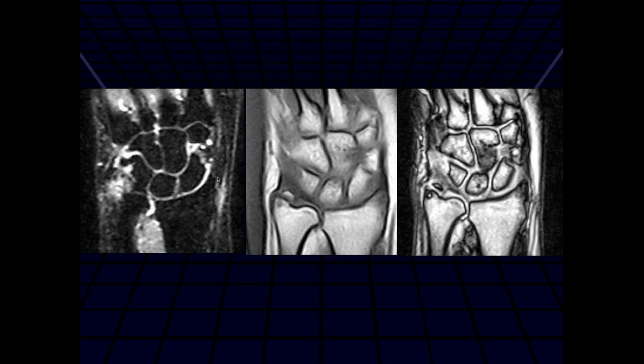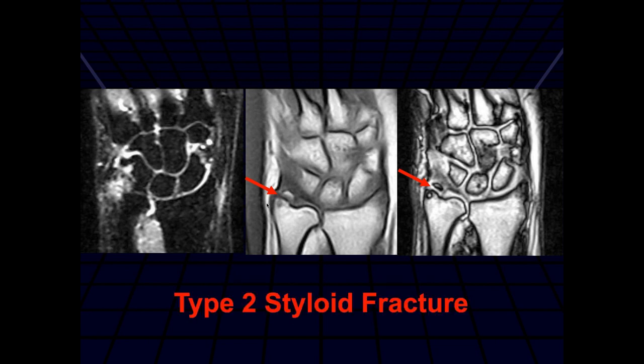Here we can see another fracture of the ulnar styloid process with surrounding marrow edema — this looks more acute than the other case. It looks like it's near the base of the ulnar styloid. I think the lower laminar attachment attaches to that fragment; I don't see the upper attachment well either, so this would probably be unstable. This shows that plain films aren't very reliable for determining stability, because many type 1 fractures on MR show the foveal attachment of the lamina is torn, making them unstable. Almost everyone goes to MR now to help make that determination.